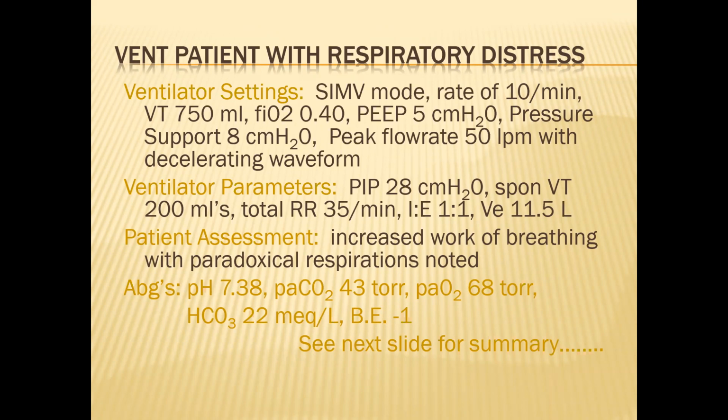After you hit 50 and starting. Very good. Yeah, typically you get up to an FiO2 of 50, depending on what hospital. It might be an FiO2 up to 50, FiO2 up to 60. At that point, you start increasing the PEEP.